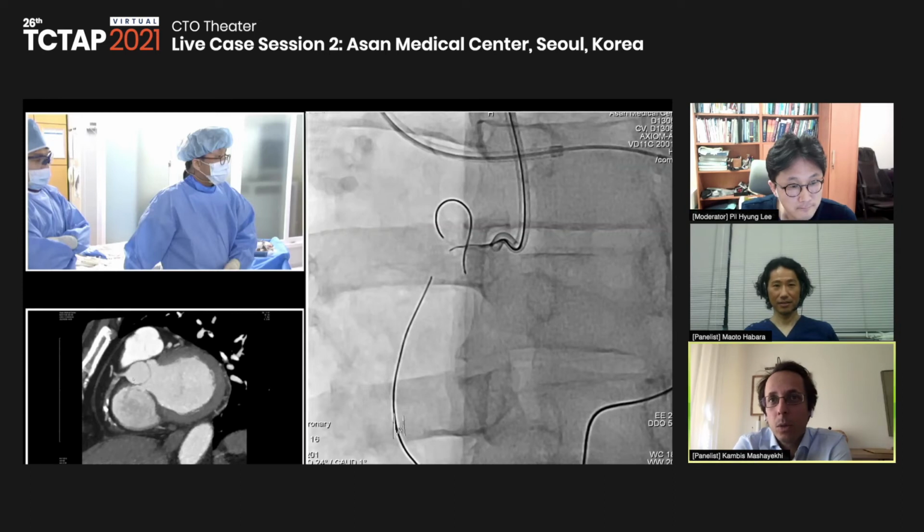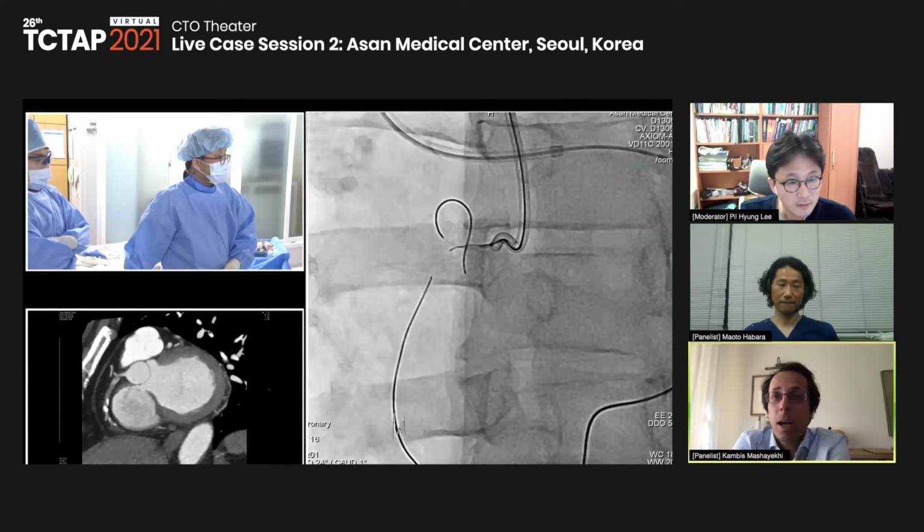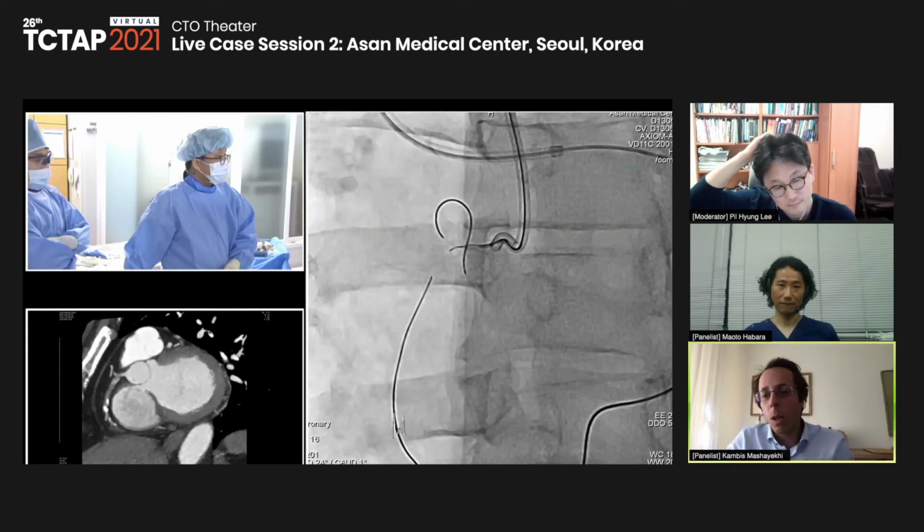Well, you know, this kind of epicardial, I would be a little bit restrictive. Sometimes if they are not so tortuous and going over a very straight apex, maybe, but I also once put a stent over such a big epicardial, stented retrogradely. But in general, I would not recommend doing that because you can't cover the whole wire with the monorail part.